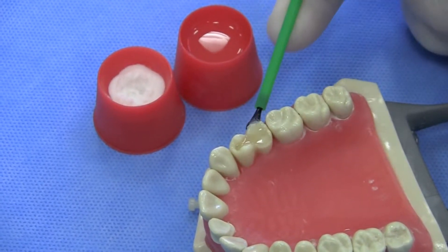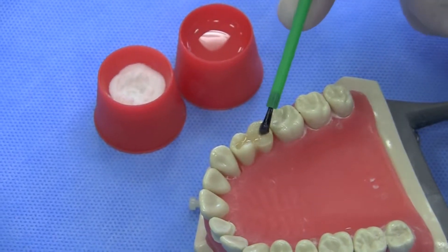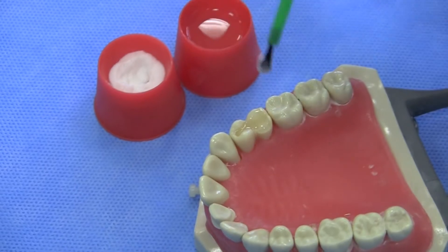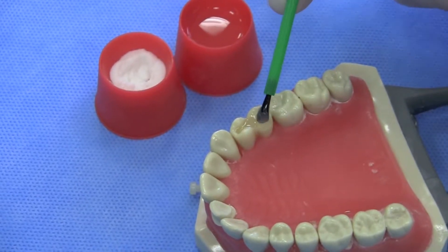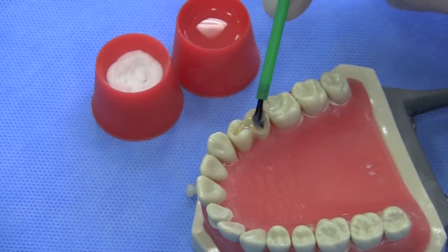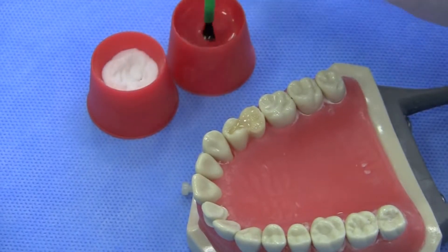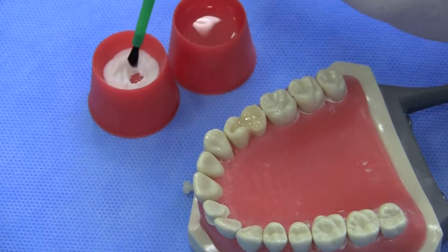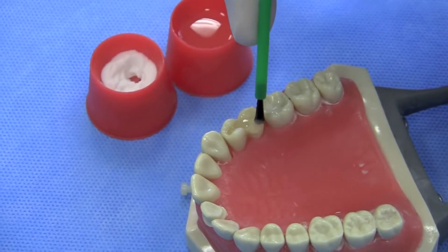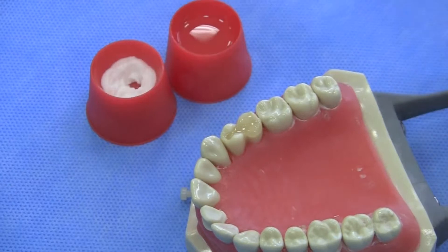And this is basically it. It doesn't have a very pleasant odor, so you have to warn your patients about the strong acrylic smell. You can add a couple of little blobs and build up a small cusp tip on the lingual for the onlay if needed. Not much effort involved.